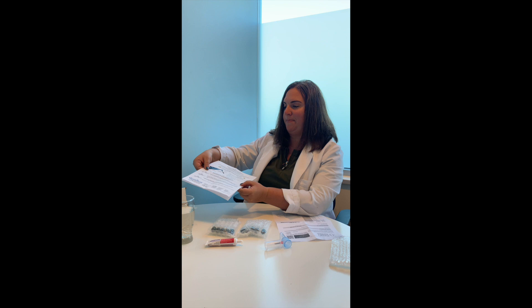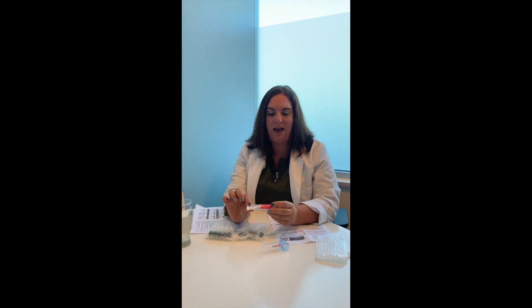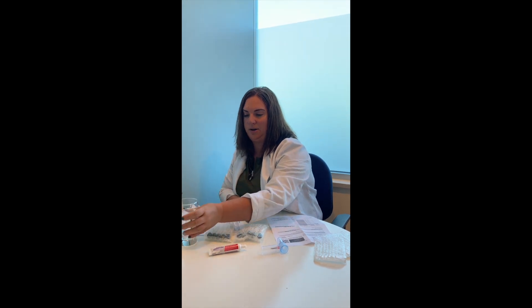You'll have meal suggestions and some important things to know, as well as step-by-step information on how to do the test. You'll have extra bubble wrap to wrap your tubes in once you're completed. And then you'll have your substrate, which will be either glucose like this one, lactulose or fructose, whichever your doctor recommends. And then you'll just have to have a glass of water ready.